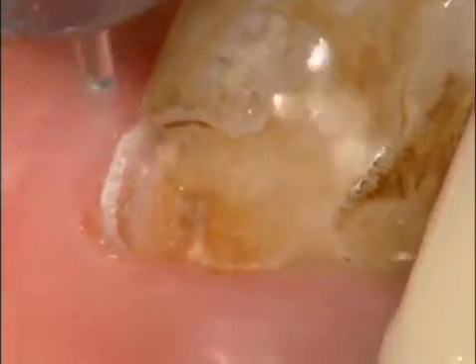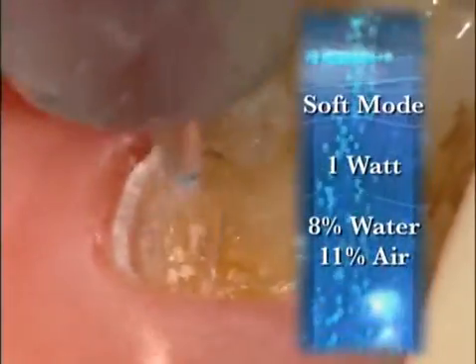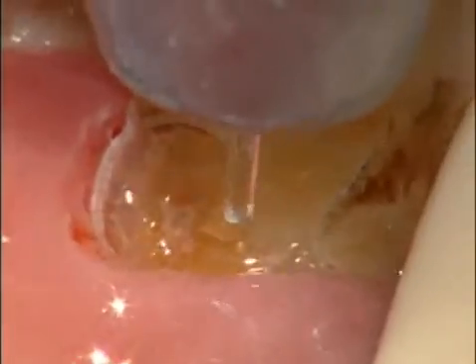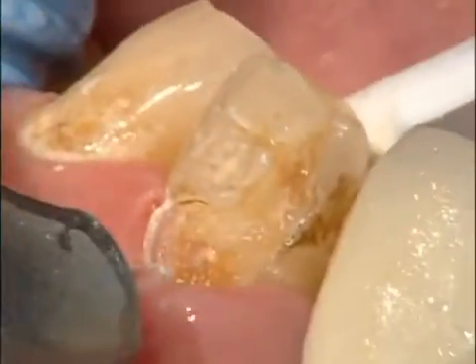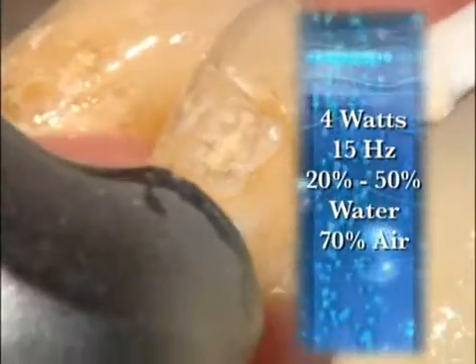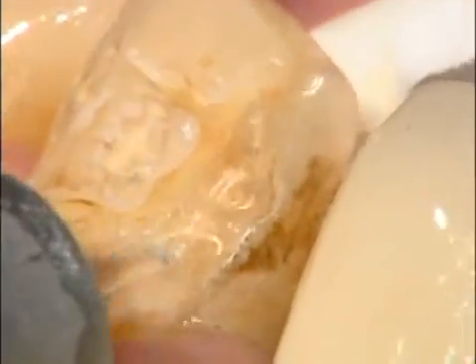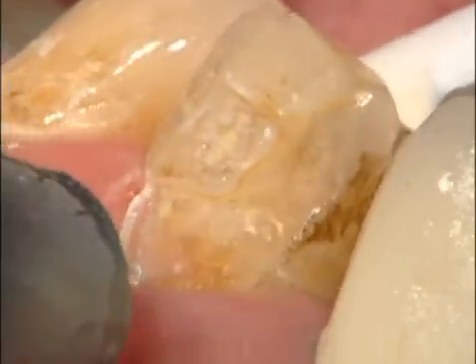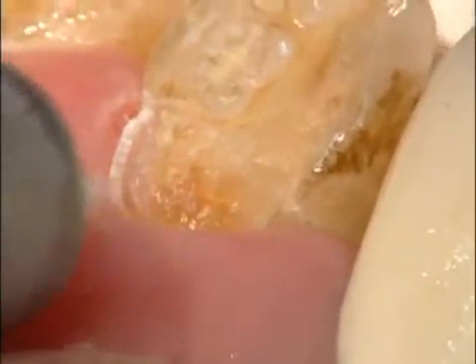So Dennis had some tissue that had grown in here, and I am going to remove that on the soft mode, the S mode, at 1 watt with 8% water and 11% air. Once I remove the major amount of decay, the real deep area, I'll drop down to 4 watts at 15 hertz, 20 to 50% water, and 70% air. Certainly, if the patients exhibit some discomfort, continue to lower the wattage. And in a patient like this, although he didn't feel anything, occasionally I will put retention in at 2.75 watts, again leaving the hertz at 15.